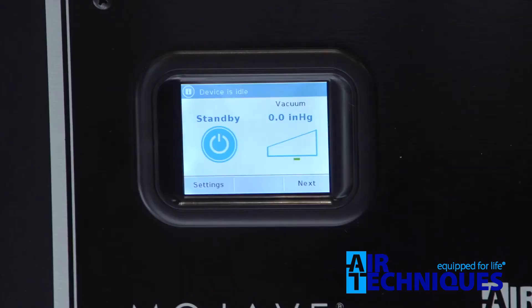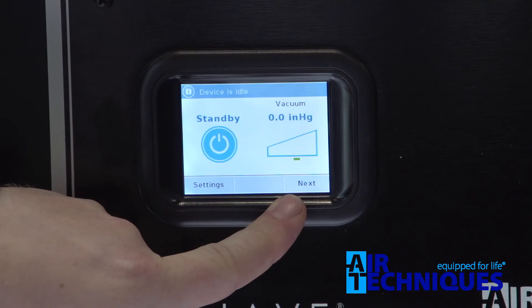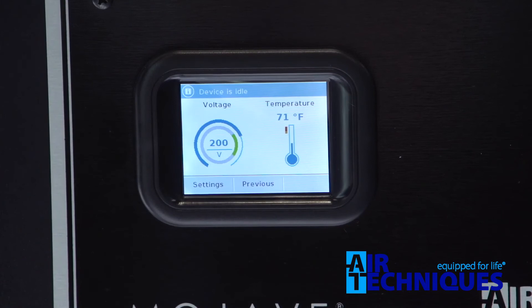I can't help but notice this display screen — that's very unique, I haven't seen that before. We took our Neo multi-color touchscreen display and put it on the device here, so it gives you widgets that show exactly what's happening with the unit. It's made for the technician so they can go in and diagnose quickly, seeing all the information at a glance — things like vacuum level, pump frequency, separator RPMs, voltage, and even the temperature of the room.